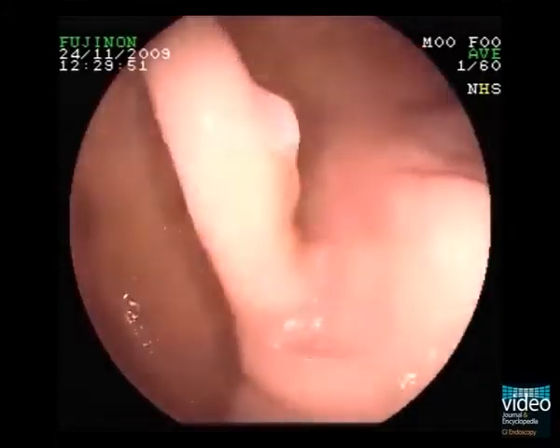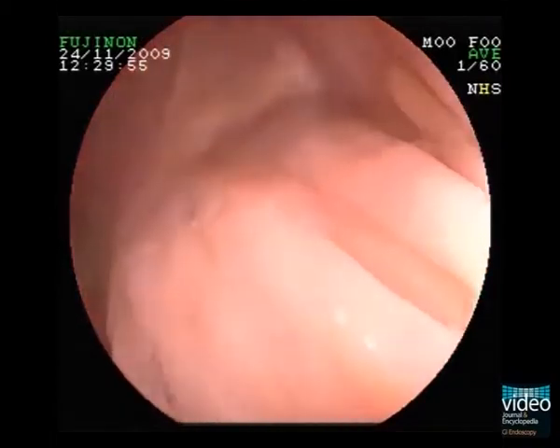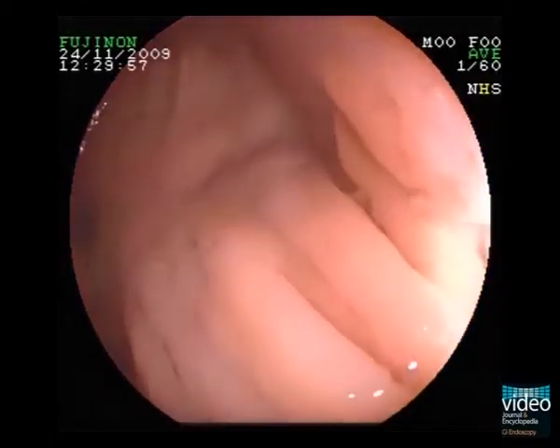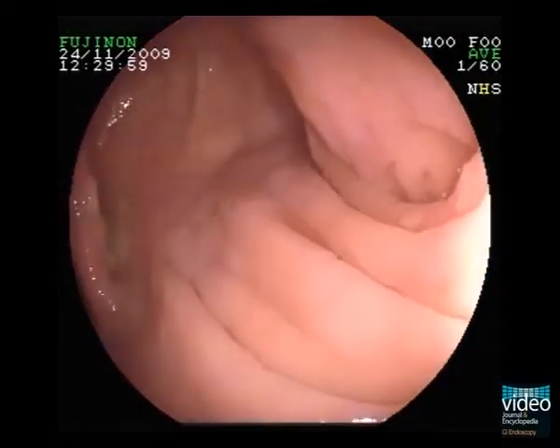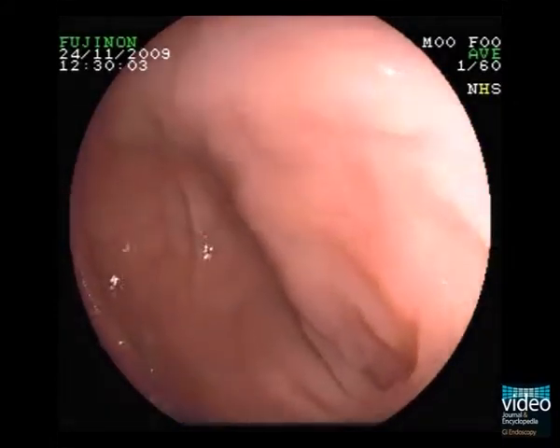Here we look at the ascending colon of a 45-year-old female patient. Without any auxiliary means, we might see some lesions, but this is truly just the tip of the iceberg.